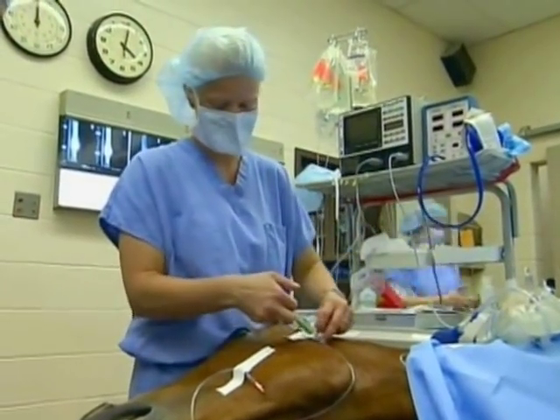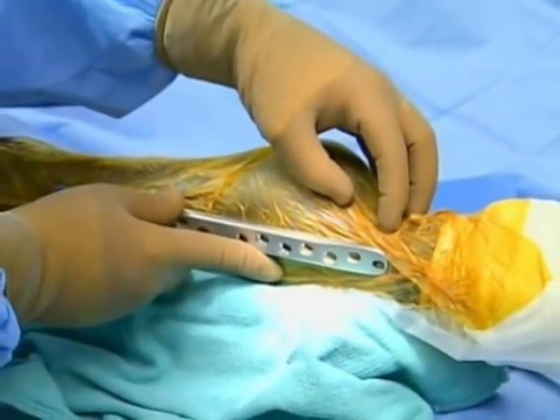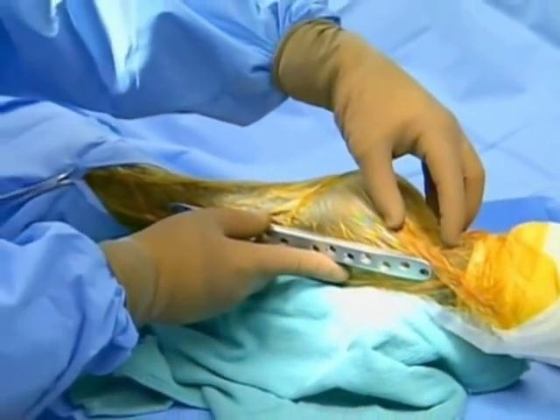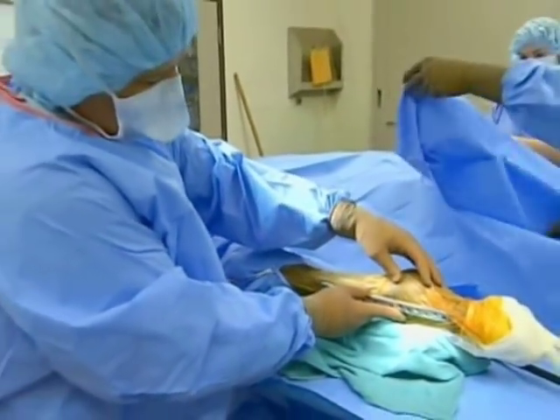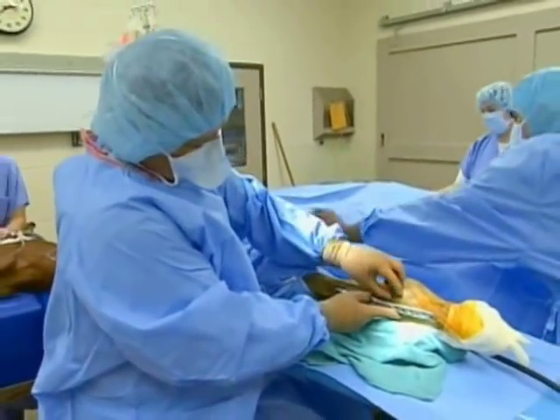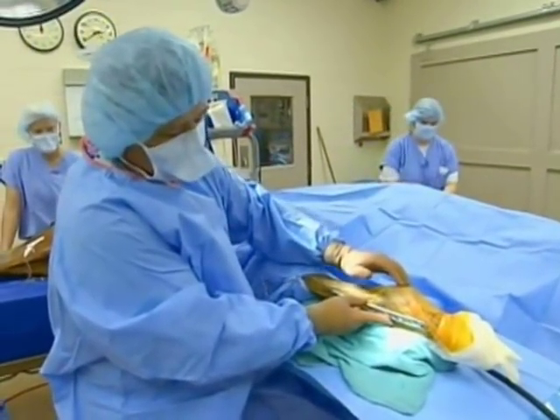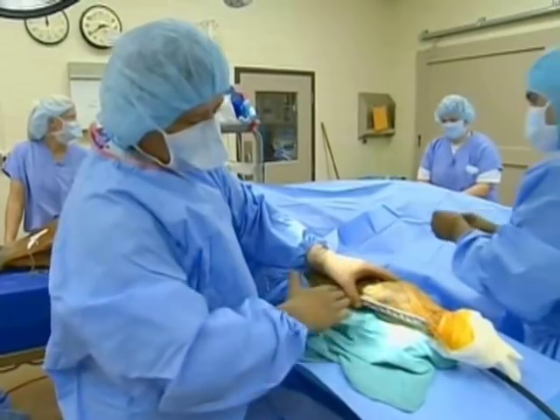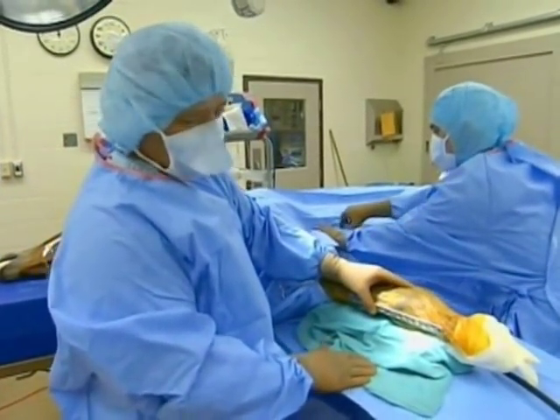This filly's having an arthrodesis — the same joint that Barbaro had. This is much less complicated than his particular surgery. This bone that we're securing the plate to was fractured in 20 plus pieces. He also fractured the condyle portion of the bone right here, and he also broke a sesamoid, which is back here. So although it's a similar procedure as far as the fusion and the arthrodesis, it's much less complicated.